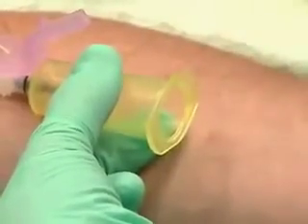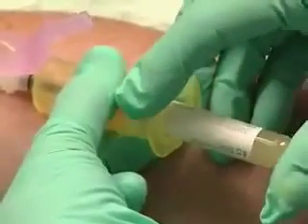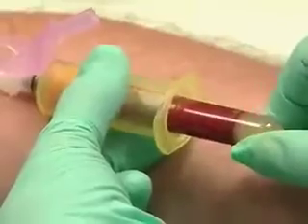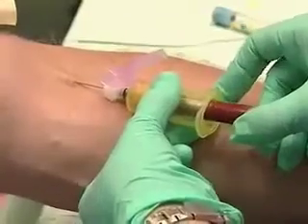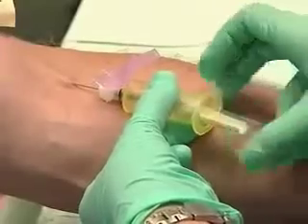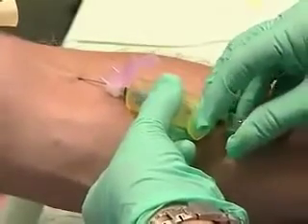In this example, we're drawing a couple of tubes for the lab. Gently oscillate the tube to mix the blood with the heparin or stabilizing agent in the tube. To switch tubes without causing the patient discomfort, steady your hand against the arm, then pop in the next tube without pushing the needle any deeper.